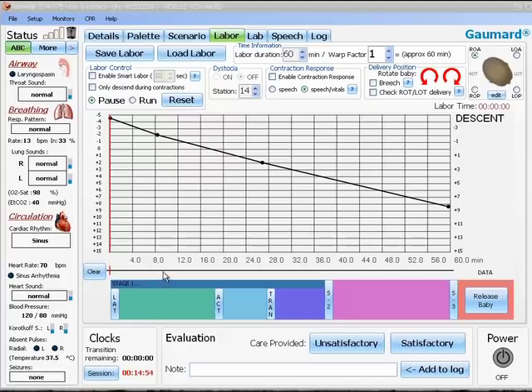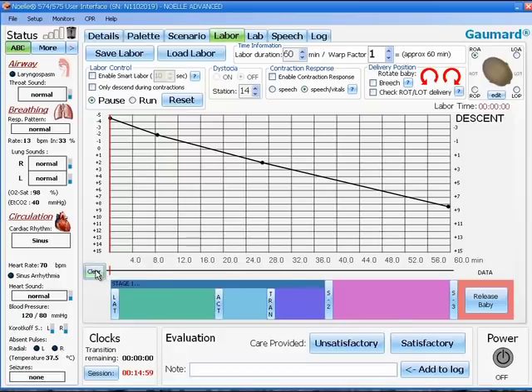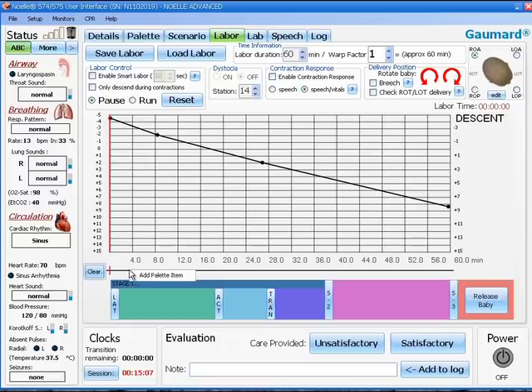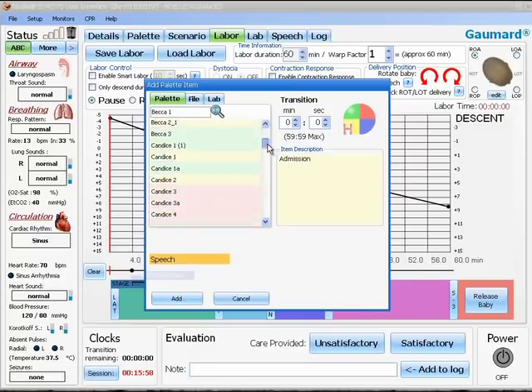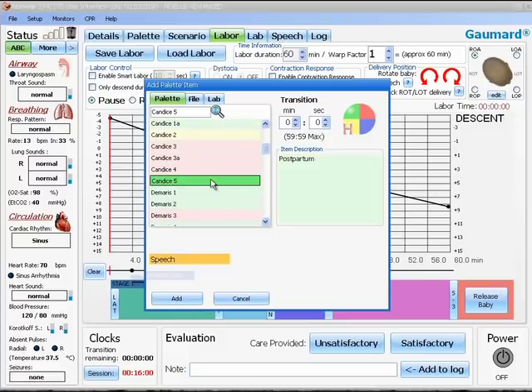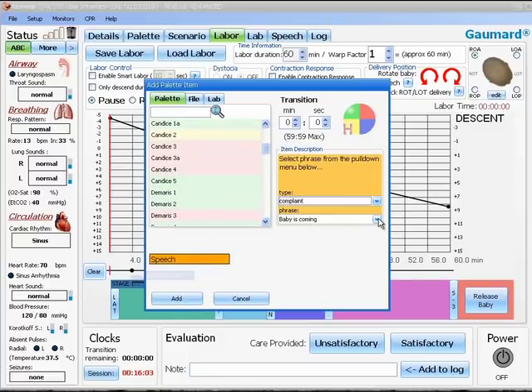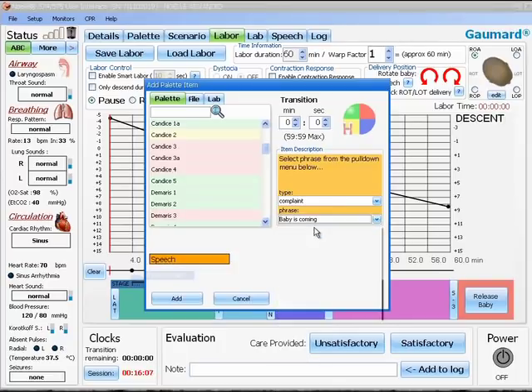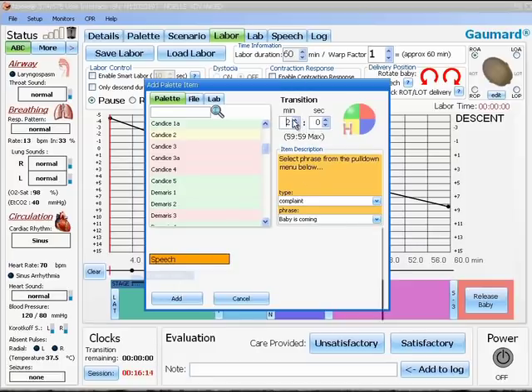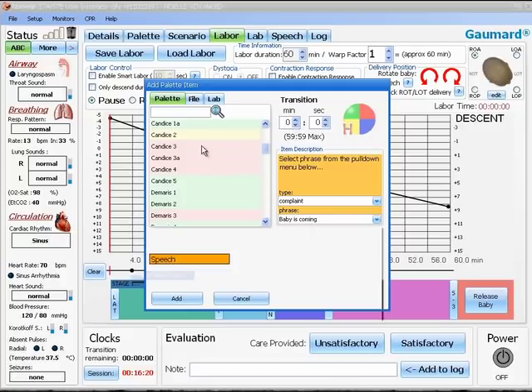Below the bottom scale is a solid black line. To the left of that line is a blue box that says clear. If you right click on this line, you can add a palette item. A new window opens whereby you can select a palette item to place on the line. It can be a pre-saved palette item such as Candice 5 or it may be a speech item in English or Spanish which could be the baby is coming. There is also a transition time that you can set for these palettes. The transition time will be the time it takes for the palette to be applied during this scenario.